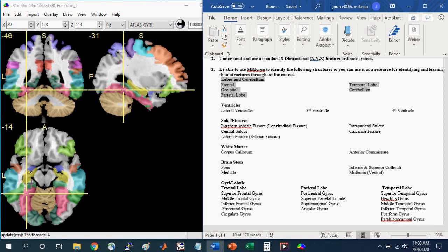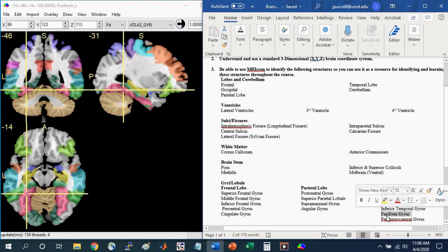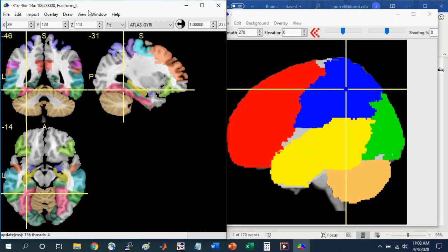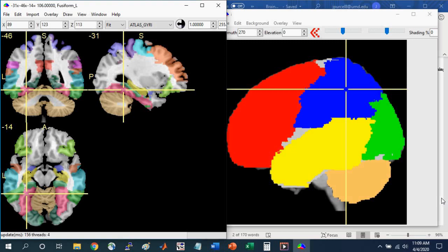For example, where the cursor is here at this crosshair, you see that this is in the left fusiform gyrus. You'll see that this is on the list down here. Again, you can click anywhere where there's color and identify the different brain regions on this list.